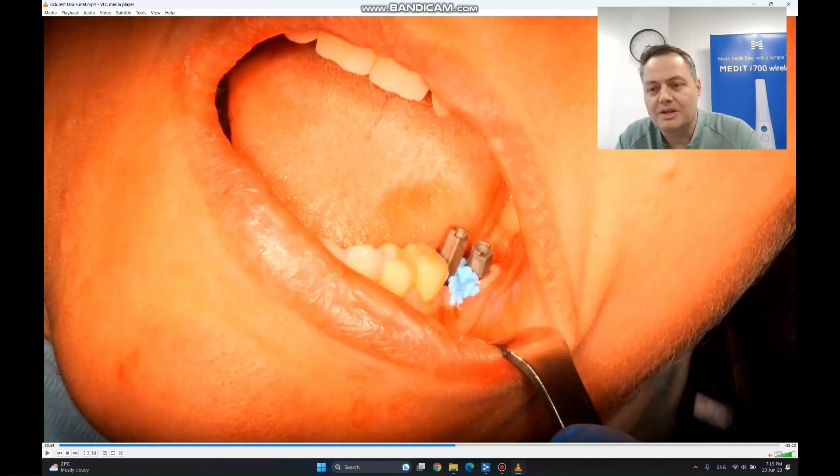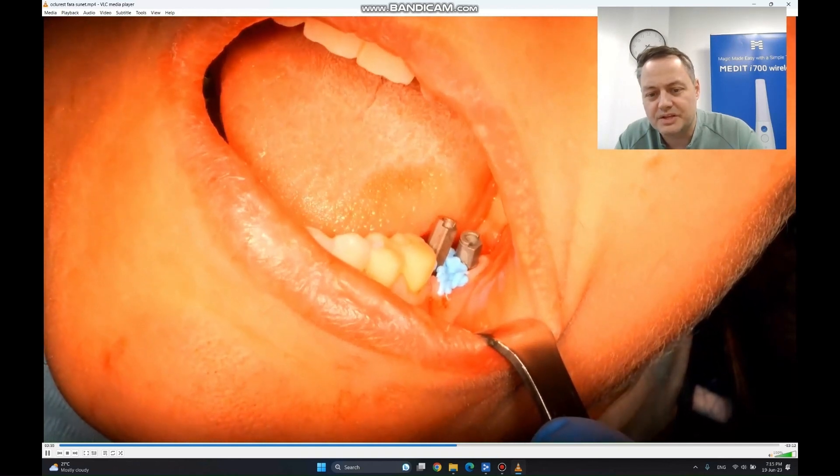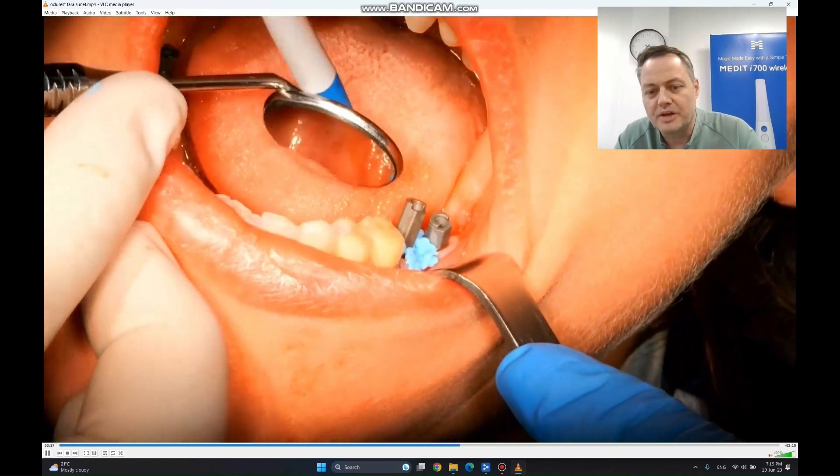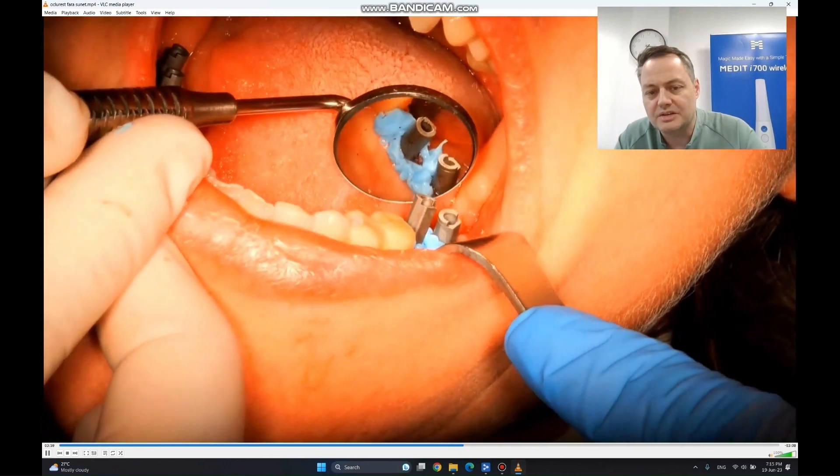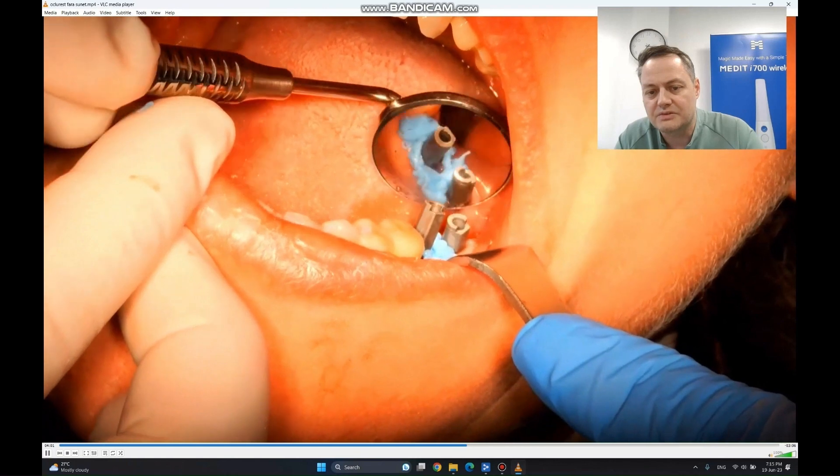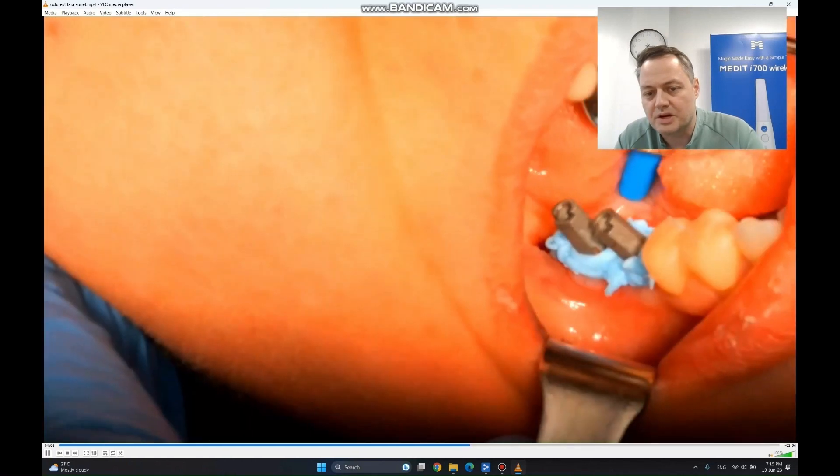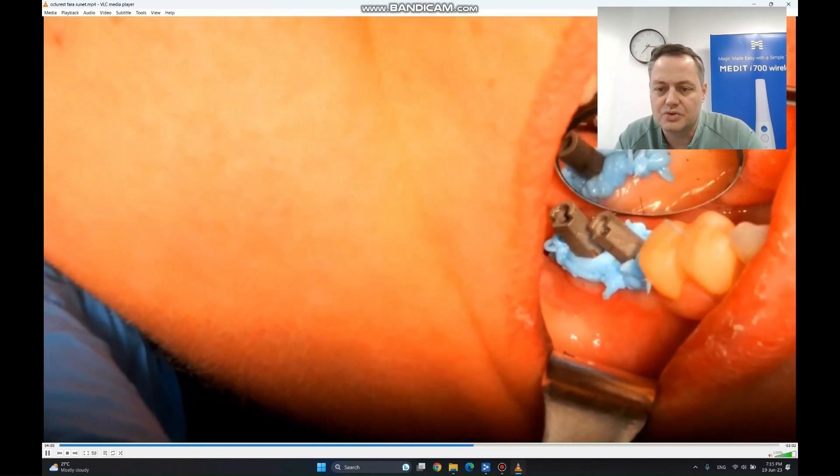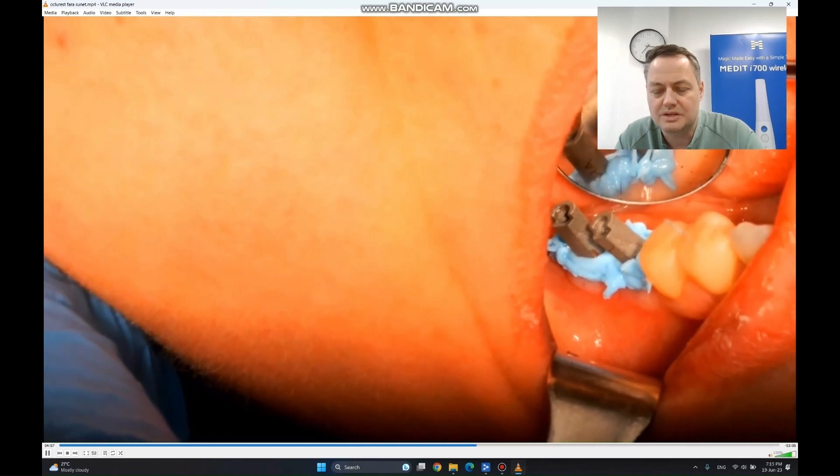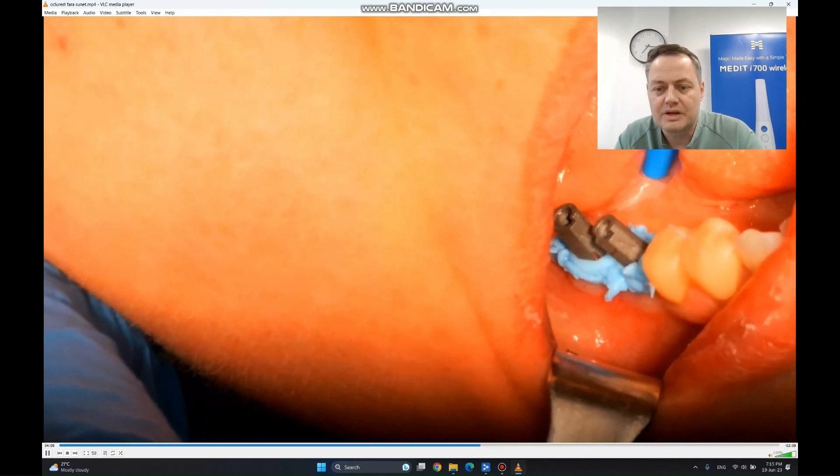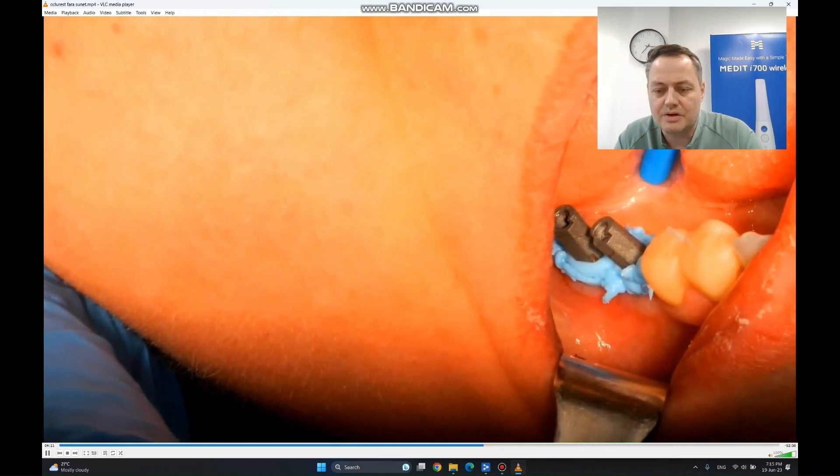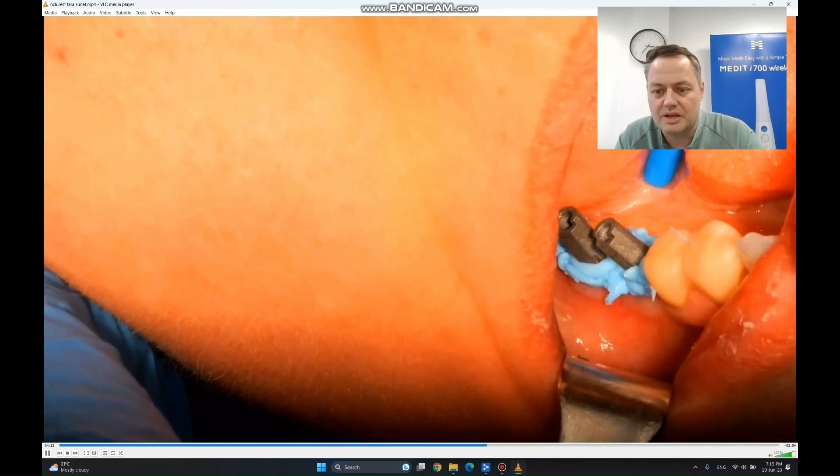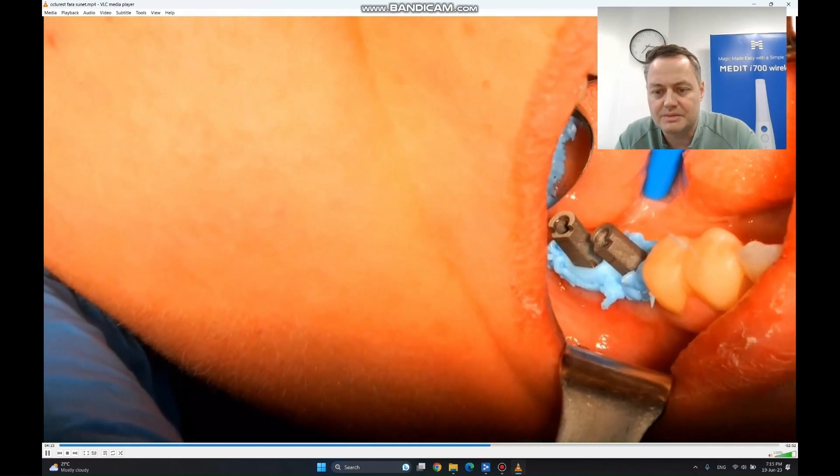But at the second scan body that is a little shorter, I only try to touch the mesial, as you can see, to be able to leave outside enough surface so that it can be properly matched. On the other side, I used two long scan bodies. I had them at my disposal. And as you can see, I covered them with material from any angle, but only the bases.